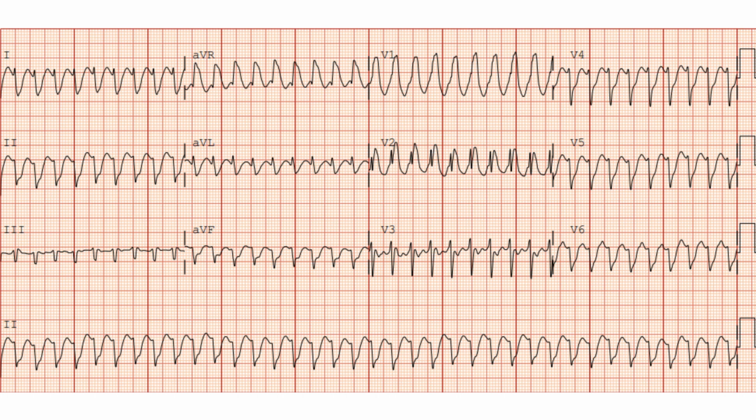Again, we don't treat an EKG, we treat a patient. So the question is, what do you do? Okay, so this guy comes in, acute onset. He looked bad. He was pale, diaphoretic. I mean, he was awake and talking, but he's like, man, I've got chest pain, and he was all gray, and he was hypotensive. So we were like, man, this guy's definitely unstable. He's got chest pain. Let's cardiovert him.